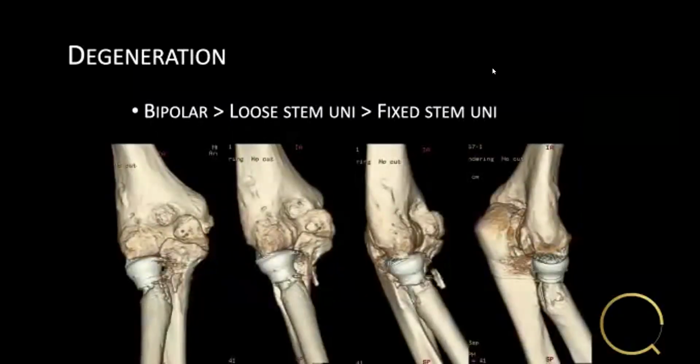And we looked at the different prostheses. We found that degeneration was more prevalent in bipolar prostheses than in loose stem uni, and less prevalent in the fixed stem uni. So the fixed stem, press fit or cemented, with a non-bipolar head, actually had a lower rate of degeneration.